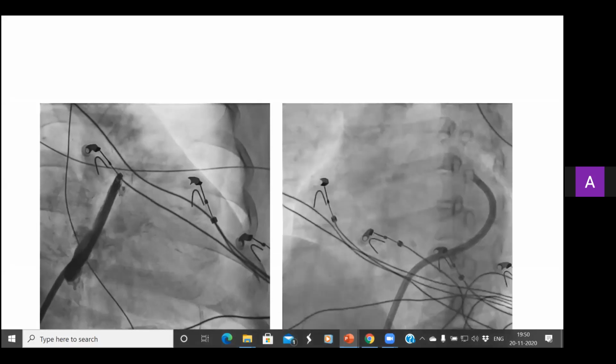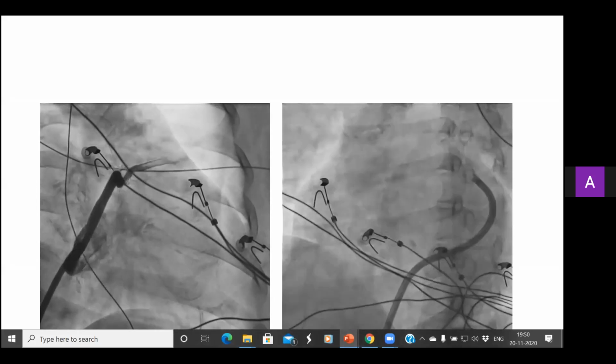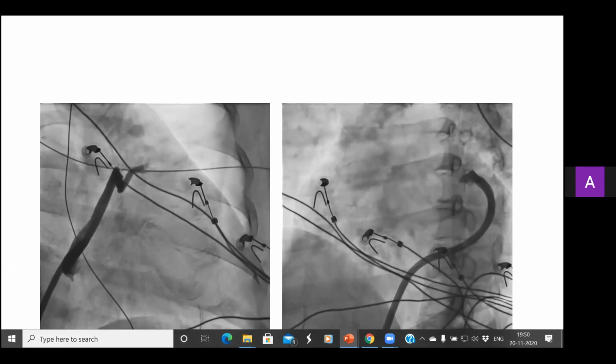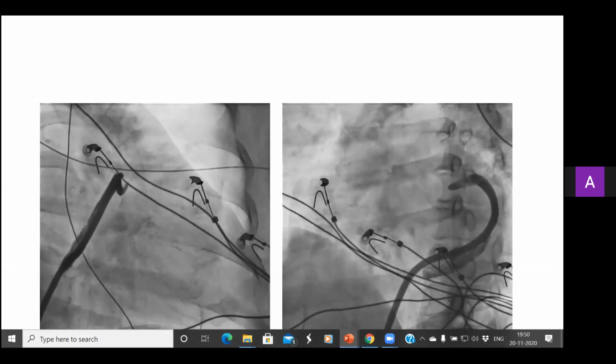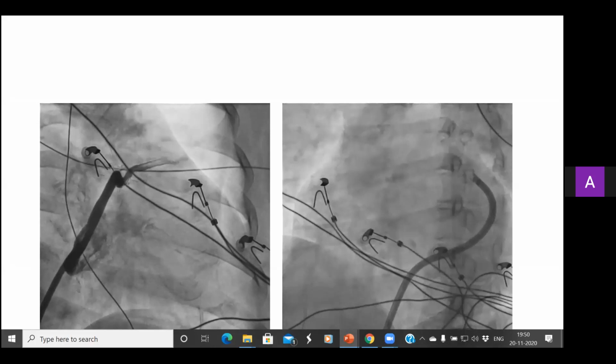So after securing the access to the coronary sinus, we proceed with the venogram through the same deflectable sheath, or sometimes using a balloon tip catheter if necessary, to delineate the course and caliber of the coronary venous circulation and, of particular interest, the GCV and AIV with its septal branches.